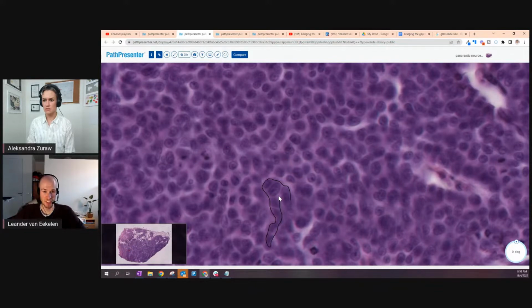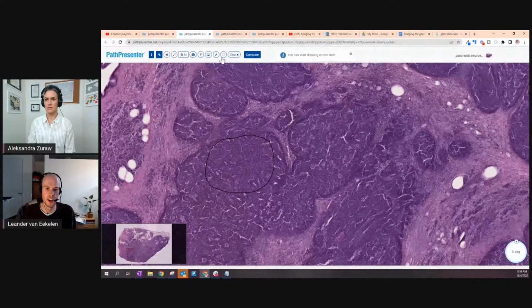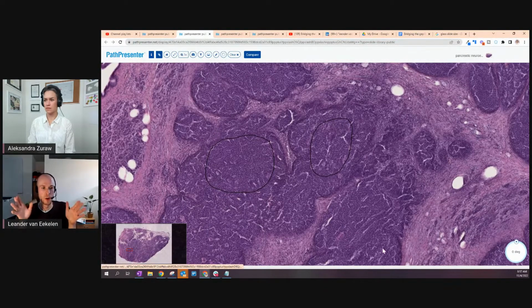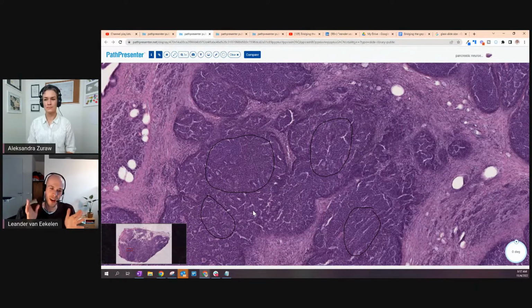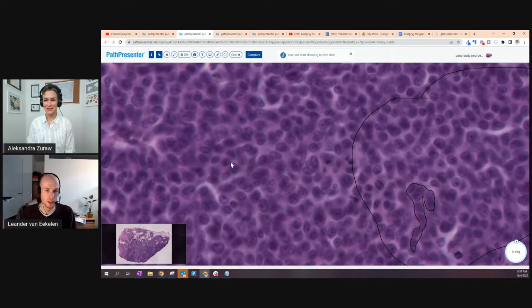Basically, you could almost already annotate the entire slide here, because they're all nuclei. Or, if we make it a little more general, they're strictly not all nuclei, you're also including cytoplasm, so we could say they're all cells. Then it becomes a lot easier to annotate. This is a nice region of cells. We have just annotated them as all belonging to the same cell type. But then, of course, there's a lot of misery, because now we want to do instance segmentation, and instead of annotating these nice big regions, you're forced to segment every single nucleus. And here the shape really matters, because if you're inconsistent, you're showing inconsistent data to your model.